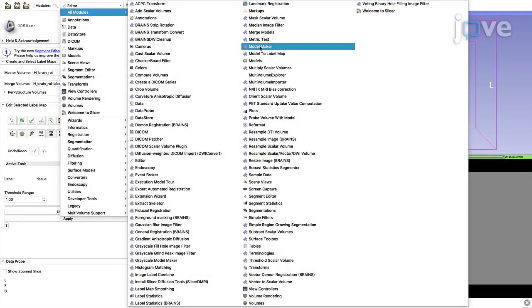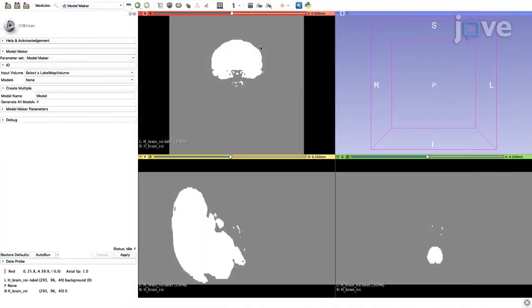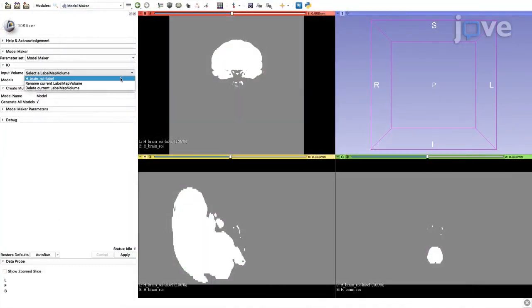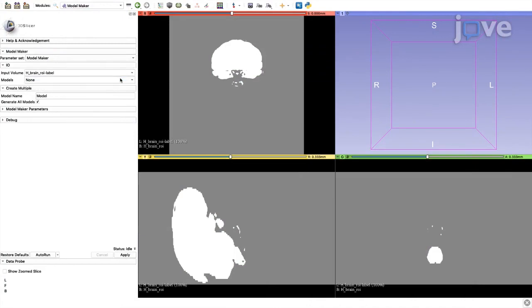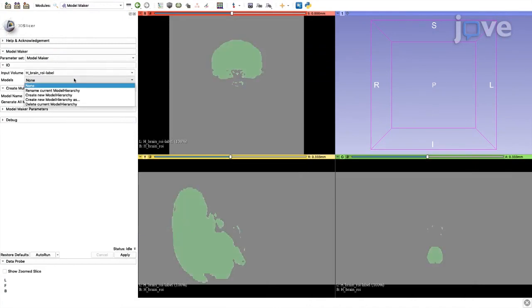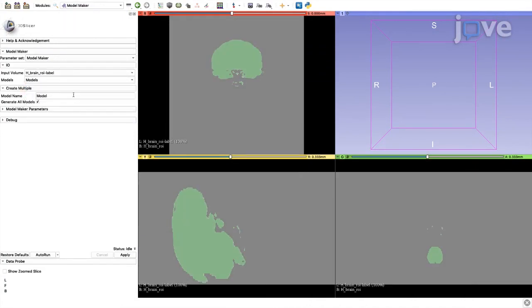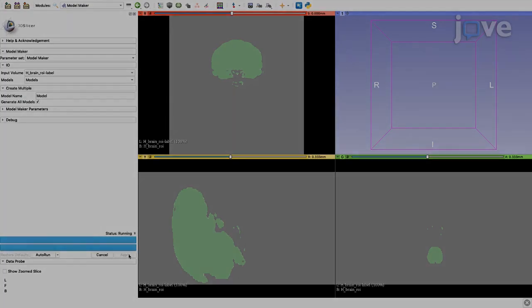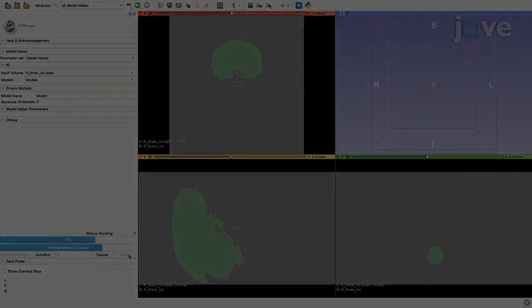Open the Model Maker module and in the Input Volumes drop-down menu, select the label map file. Under Models, select Create New Model Hierarchy and click Apply to create the volume.